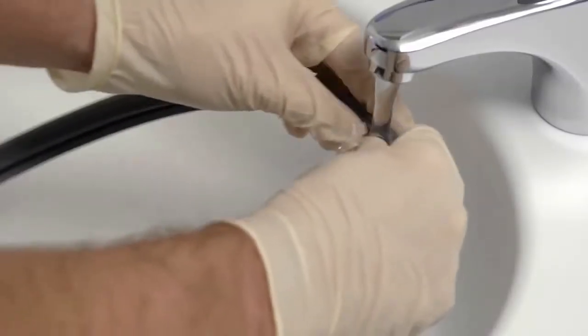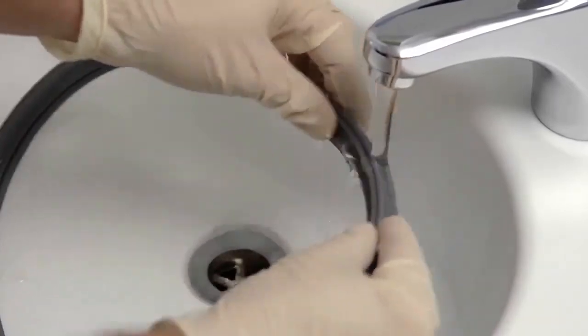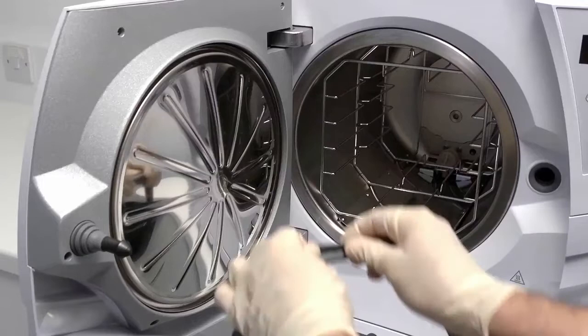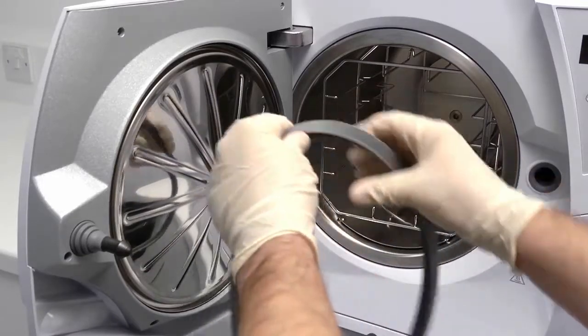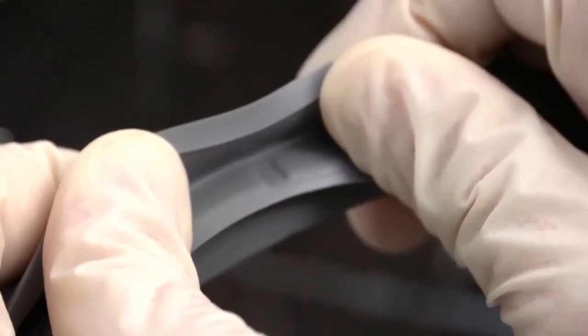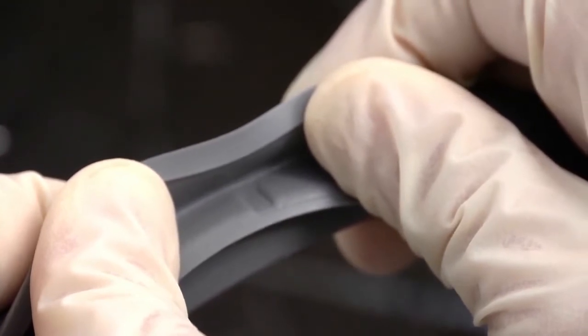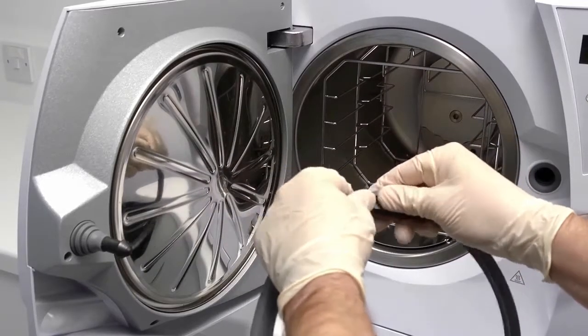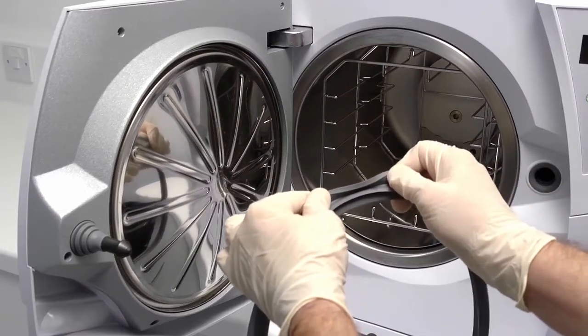Before fitting a new door seal, it should be moistened with water to aid seating it into the correct position. Within the groove of the door seal, there are four markers at the 3, 6, 9 and 12 o'clock positions. These markers will help you to fit the door seal correctly without overstretching it.